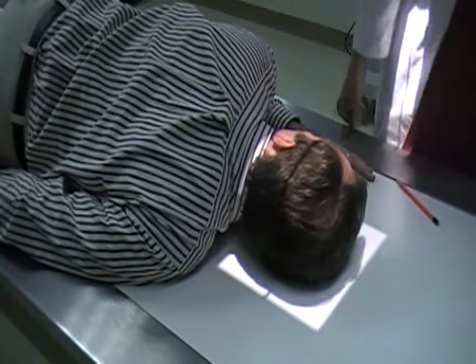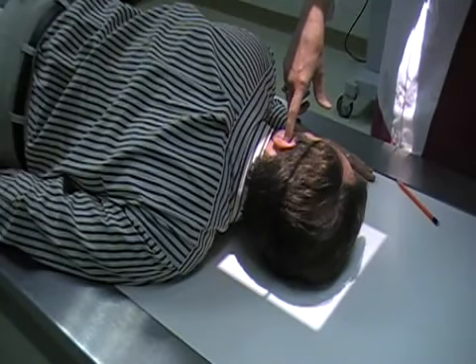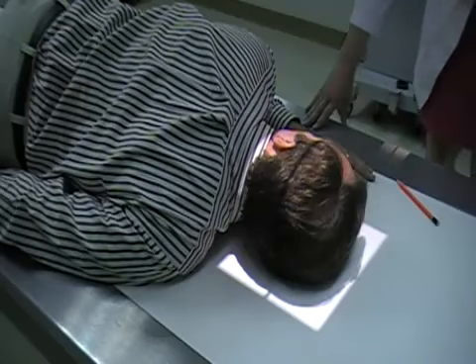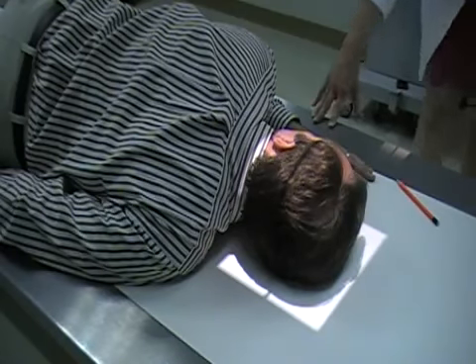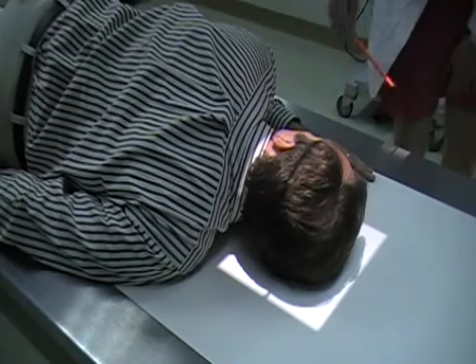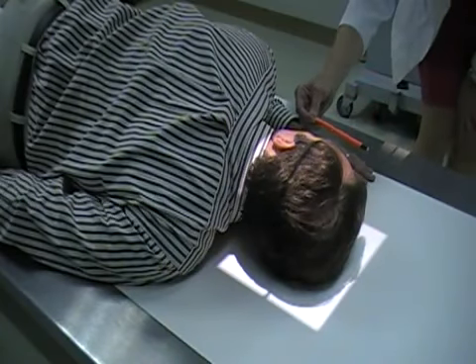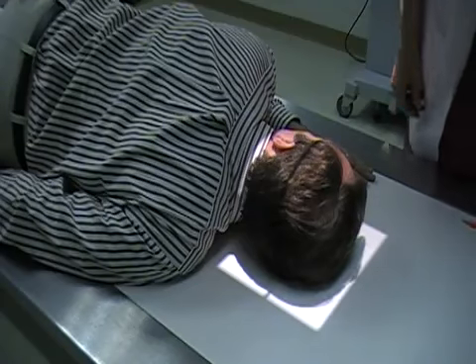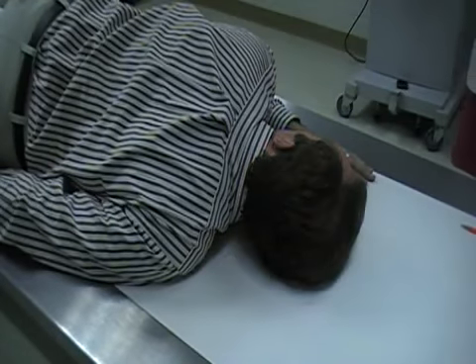Central ray is going to be 2 inches above the EAM. You want to double check, make sure that the interpupillary line is going perpendicular to the table. And then, of course, we want to check our mid-sagittal line, make sure that it is horizontal. Okay, that is our right lateral.